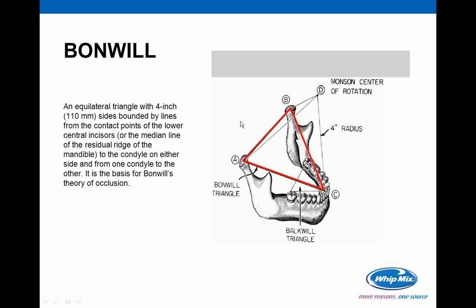Now, this average of 110 millimeters is generally what most large frame articulators are built on. This 110 intercondylar space. So we're going to duplicate this Bonwill as we set up our models within the full frame articulator so that we can be in a natural average of patients that are out there.